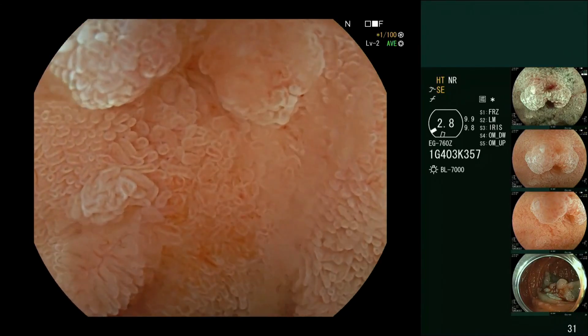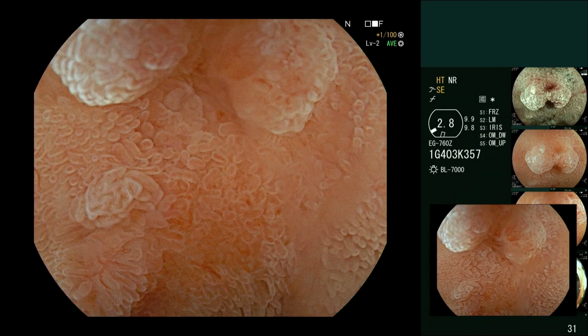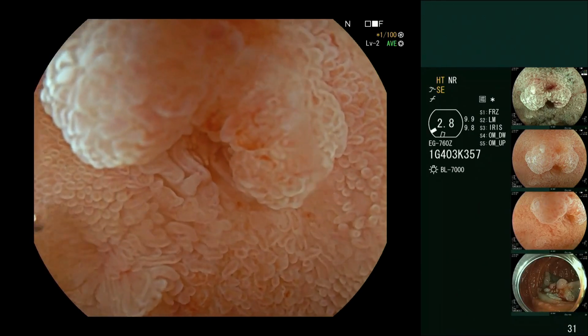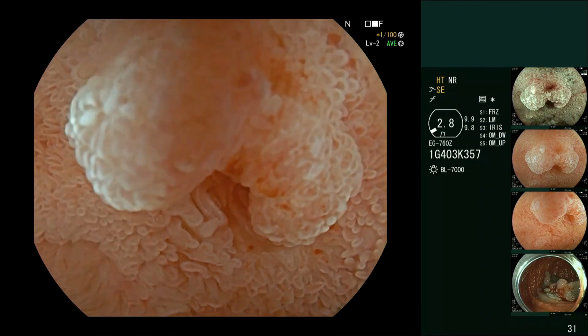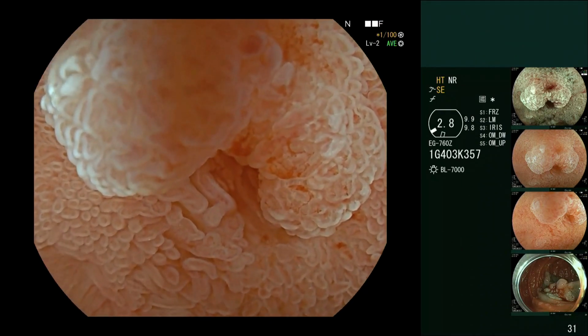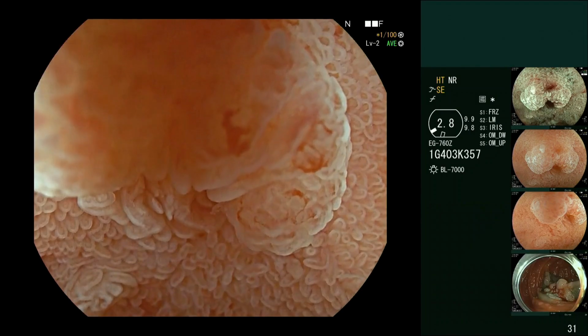So here we go. You can see the orifice very clearly in this image now at the 12 o'clock. And you can also see polyp around it. So this is recurrent polyp after an ampullectomy procedure. It's relatively common in FAP patients. You can clearly see the orifice going here from the center of the screen up to the 12 o'clock.